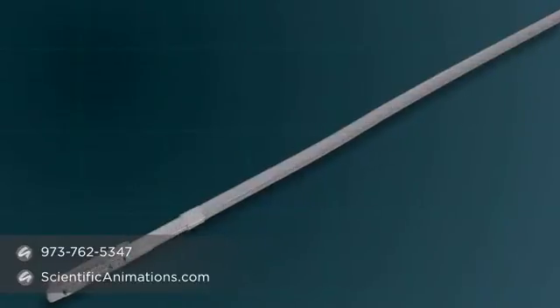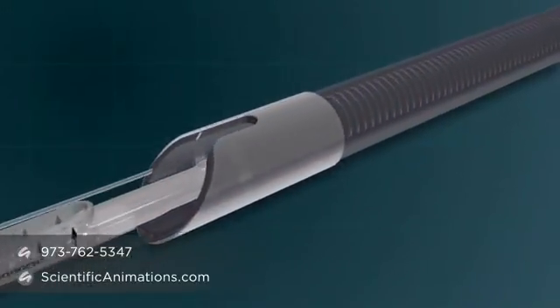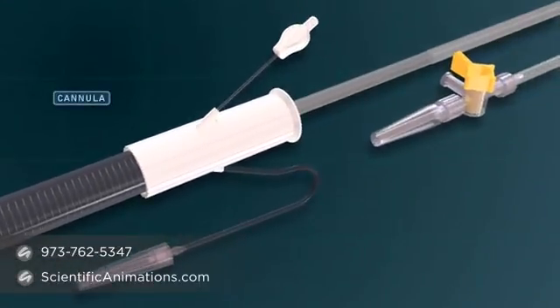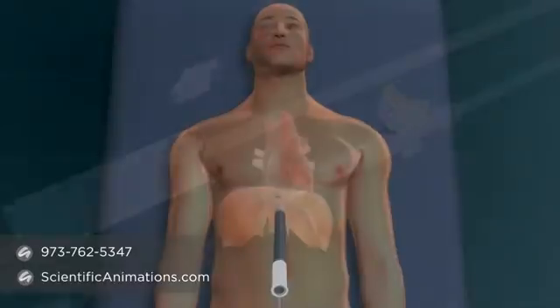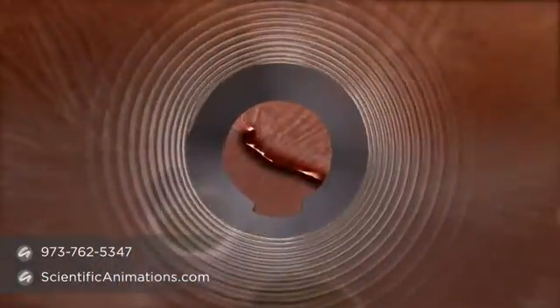The technology consists of an innovative suction-irrigated radiofrequency coil, named Visatrax, deployed utilizing a cannula through the abdomen. The cannula is inserted through the abdomen and into the pericardial space.